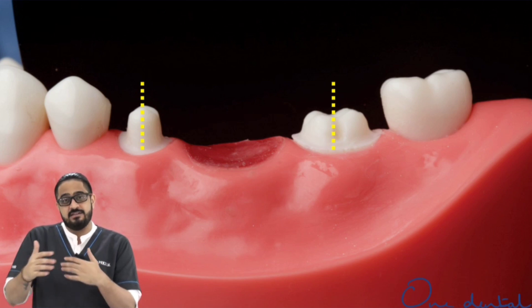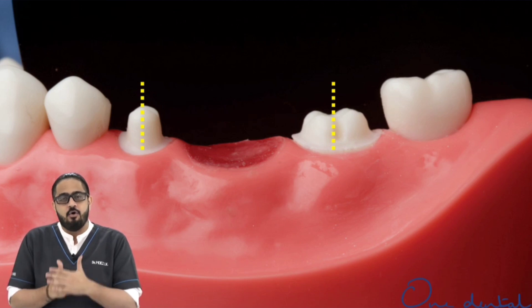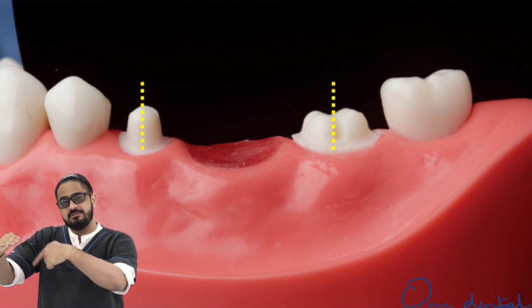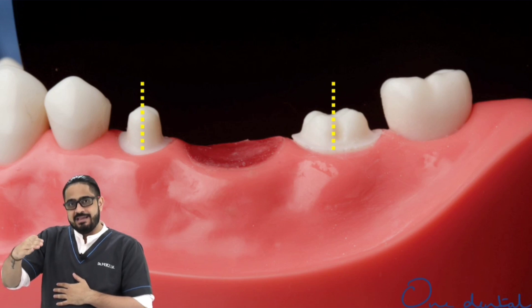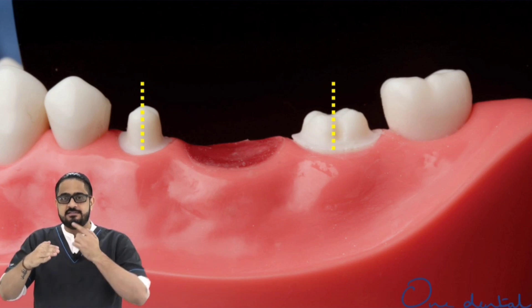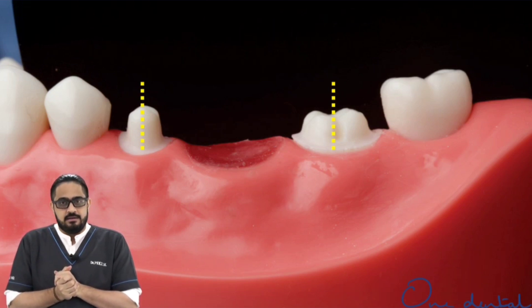How do I ensure whether I have the correct parallelism or not? I can easily do this with the help of a mouth mirror. I hold the mouth mirror at an angle so that I can see the 360 degrees of my preparation on a terminal tooth. Hold the mirror at the same angle and keep coming anteriorly. When I come anteriorly with the same angle, I should be able to see all 360 degrees of my anterior tooth preparation — then I have ensured my desired parallelism.